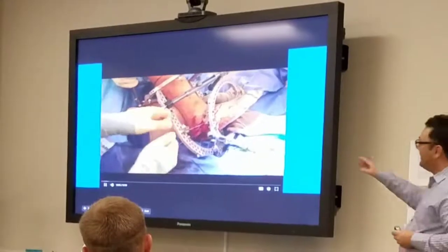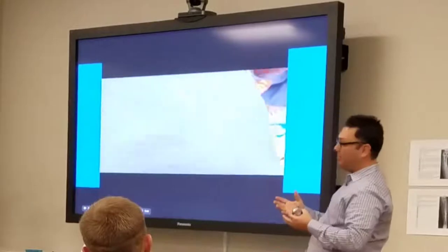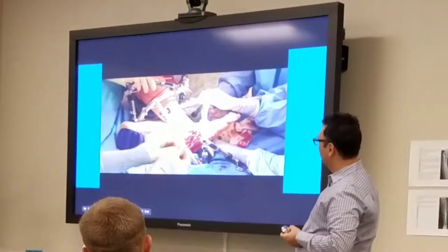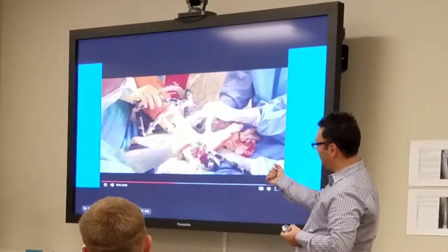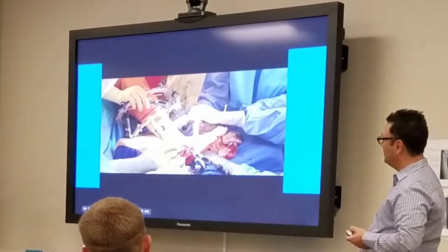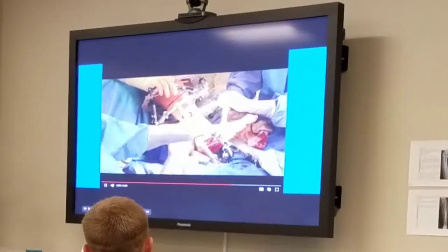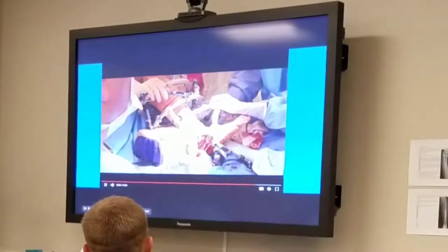What I find is you really have to have somebody holding the leg on the other side. And that bone is tough. Sometimes you can yank that off of the Gigli saw, but you've got to have a lot of counter pressure. That's what it means by getting caught up in there. You see how I have to get it started. That's what happens when you stop in the middle. It'll catch on to the bone.